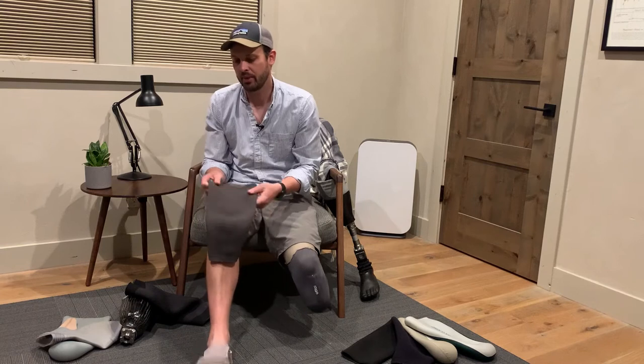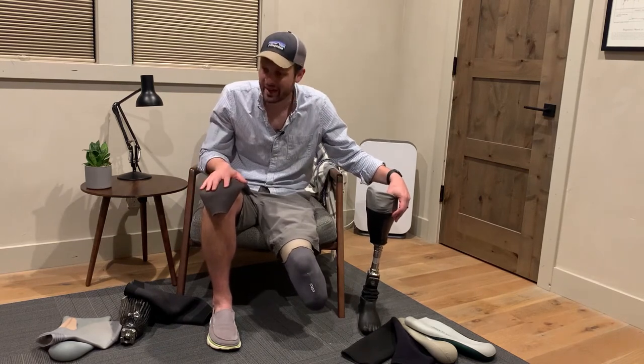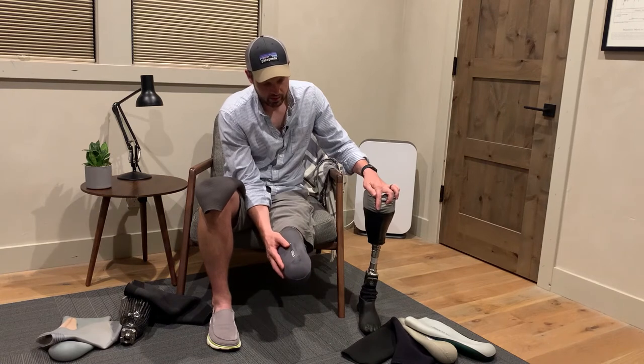You have to kind of readjust, roll your sleeve back up. Shorter ones are nice in that less of your leg is covered, so with issues like sweat, temperature, and heat it's nicer to wear less — just like wearing shorts versus wearing pants. However, there's a big trade-off because you lose a little bit of security. A good friend keeps two sets of liners — ones cut really short so they're just above the top of the socket.